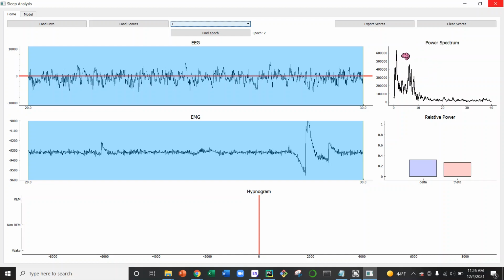So here in the power spectrum for this EEG snippet, we're seeing there's a lot of low frequency power, right? There's a slower wave that's making up a big part of this signal. Then it goes down a bit, and up around 5 to 10 hertz there's another peak. So there's a slightly faster component making up a pretty big portion of the signal. Then beyond 10 hertz, these higher frequencies, there's really not much, right?